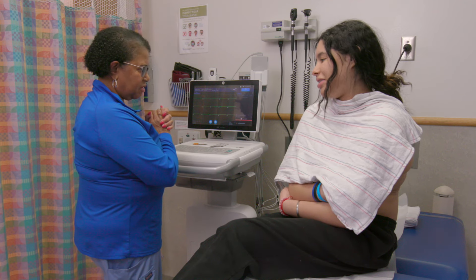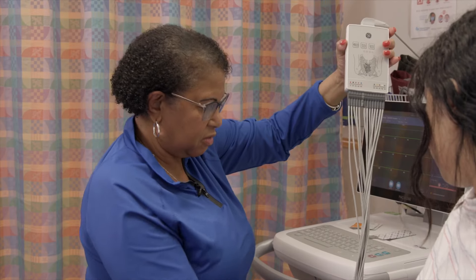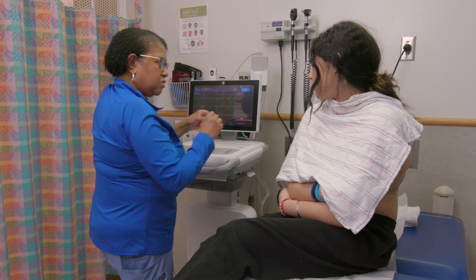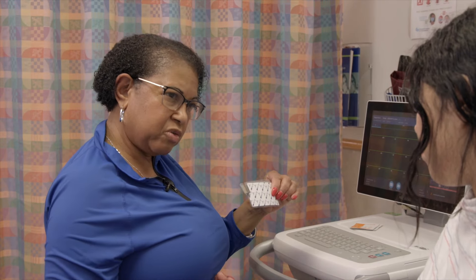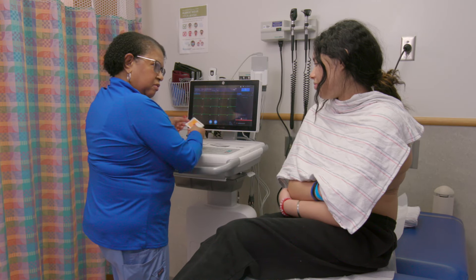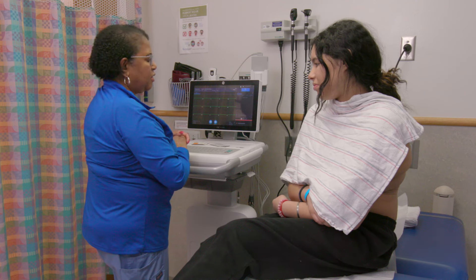It does not hurt. So we put stickers on your chest, and then we put the electrodes, which are the stickers, to the wires. I just need to prep your skin first with a little bit of alcohol, and then we put the stickers on. Comfortable with that? Okay, wonderful.